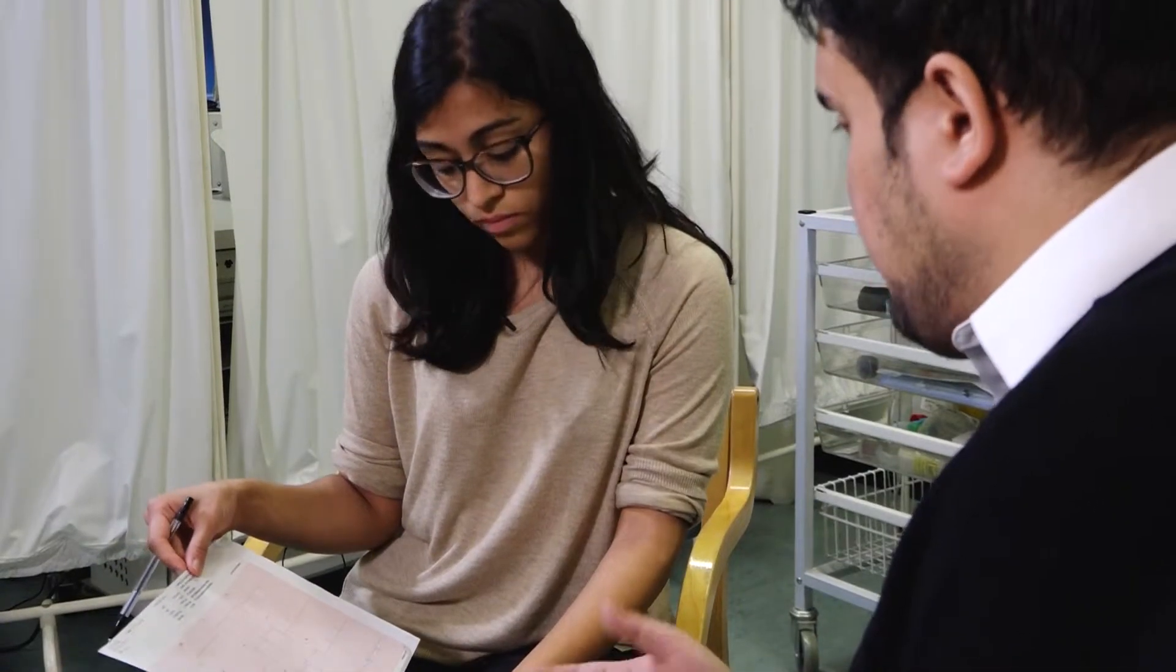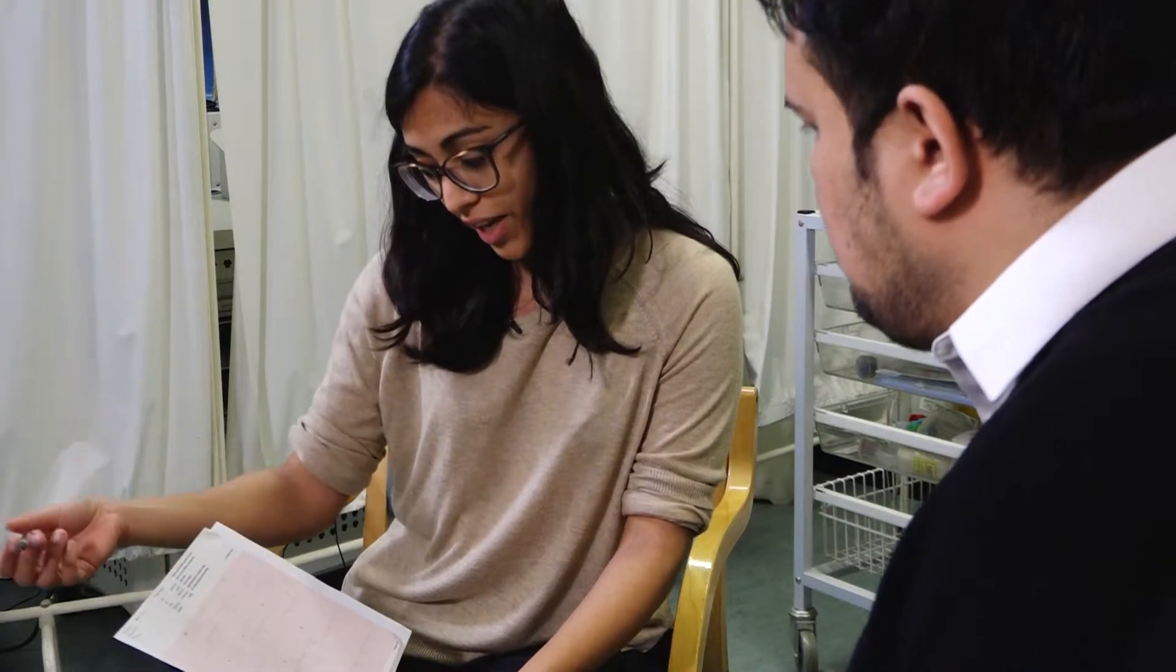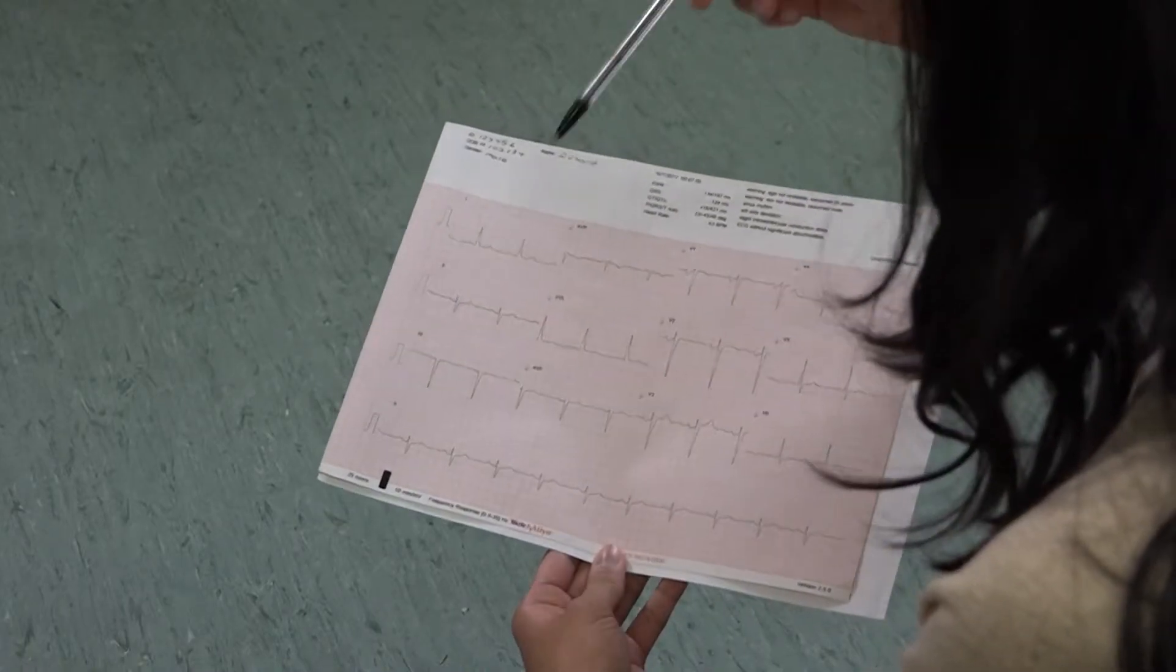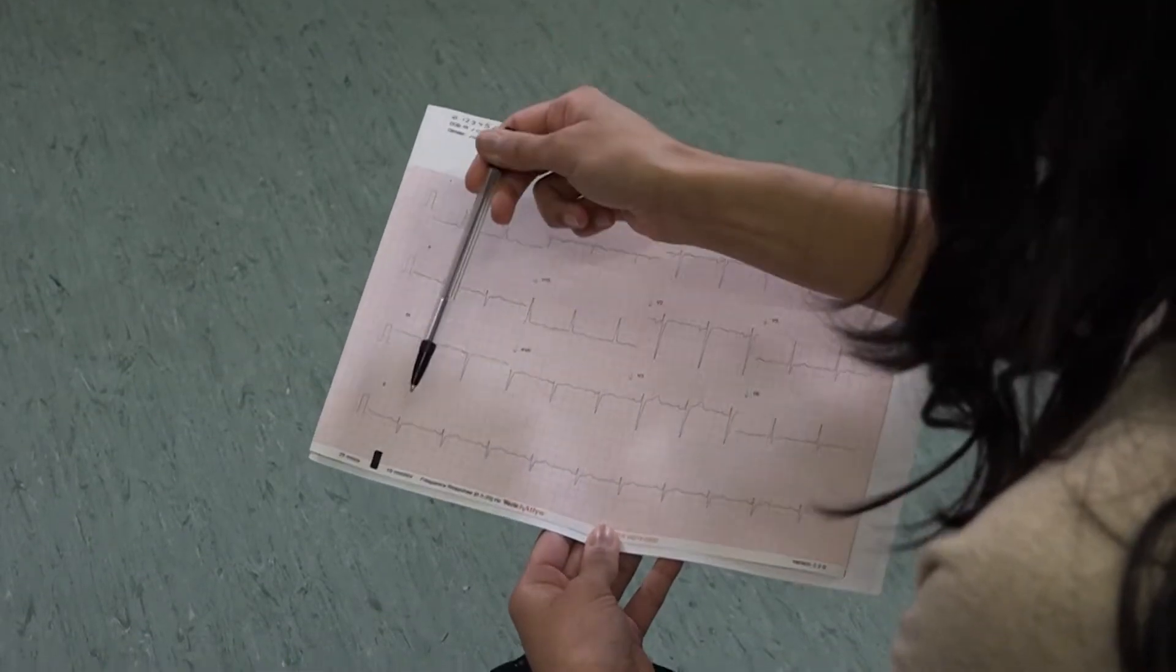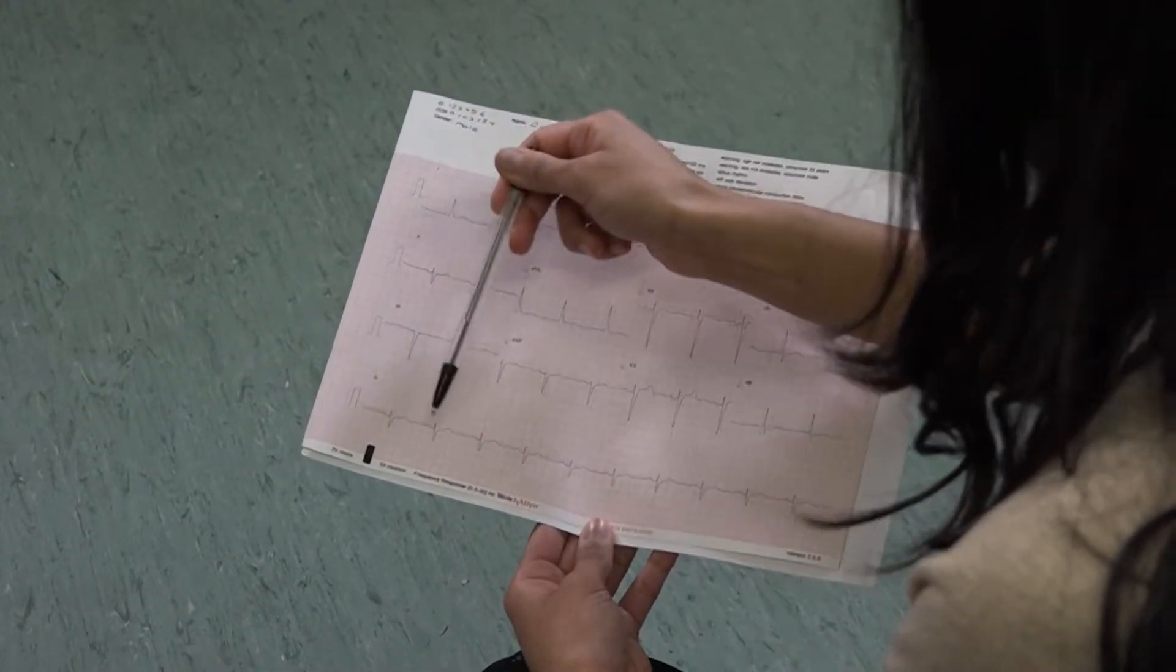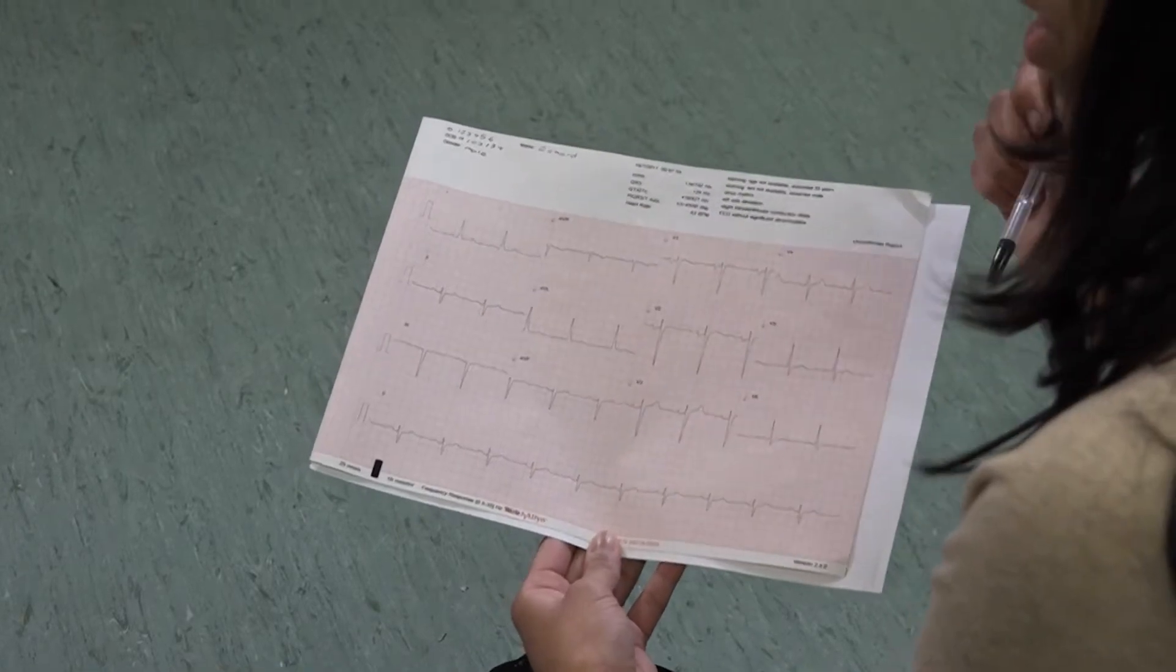In this case, the heart rate is approximately 60 beats per minute, and we can find that out by calculating the QRS complexes and timesing it by six.